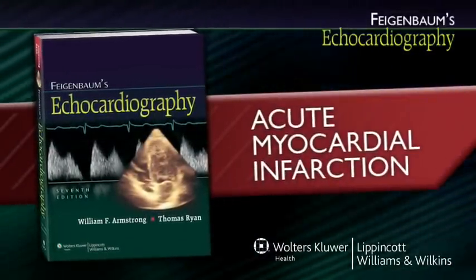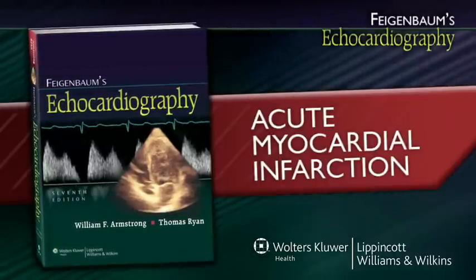Acute Myocardial Infarction, from Feigenbaum's Echocardiography, 7th edition.